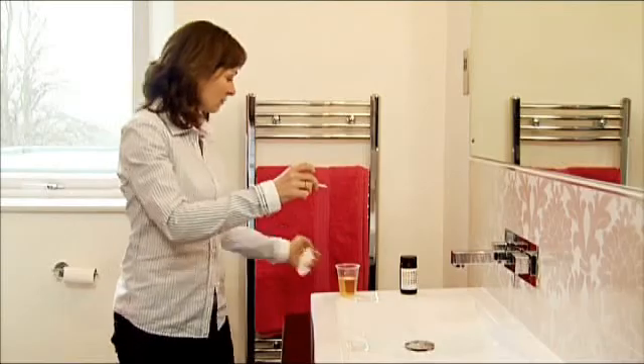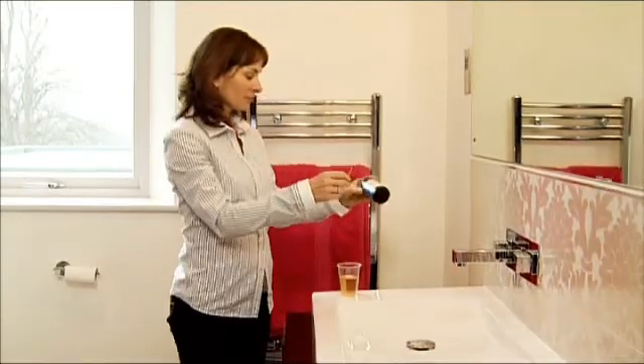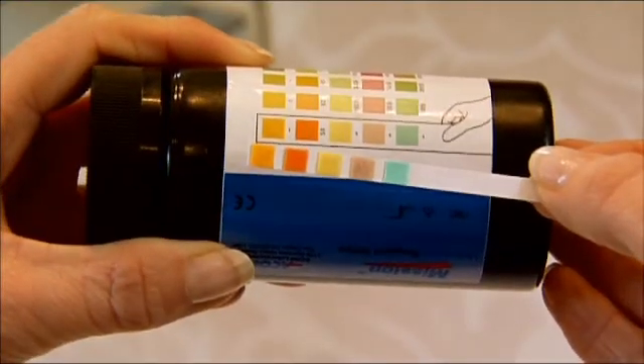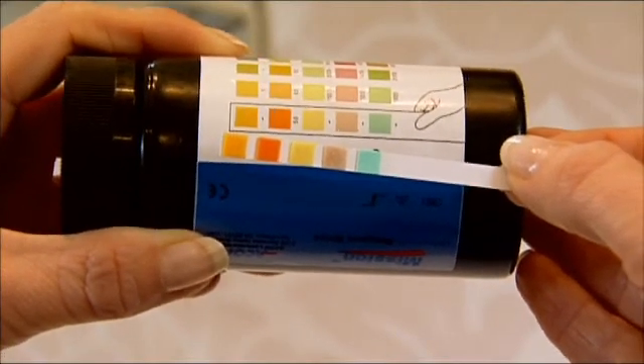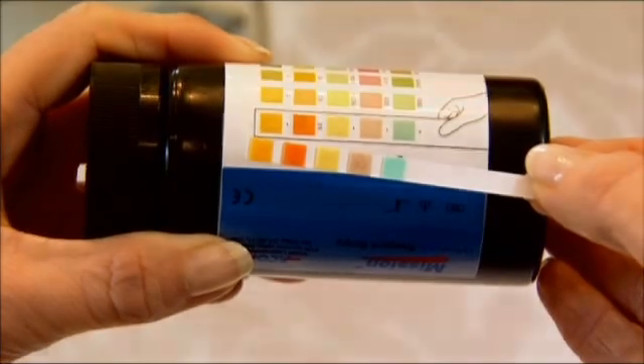Now compare your dipstick colors against the color chart on the jar. In most cases none of the colors will change, but make a note of any squares which do change.